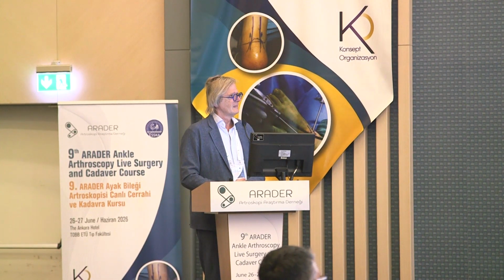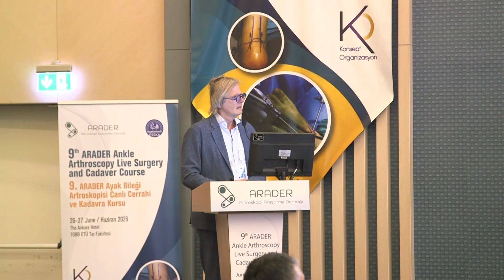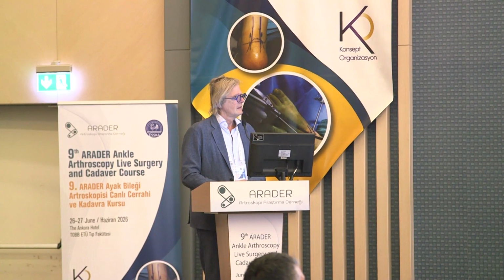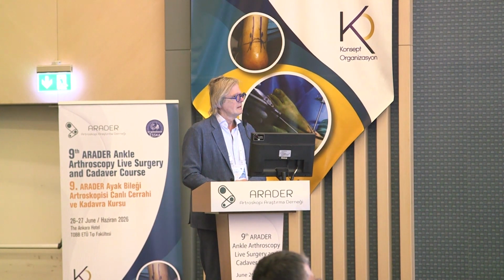Yeah, I want to ask a question just for me. You have an extraordinary career and you witnessed so many things about ankle arthroscopy. We all know that there was an article in 1939, Burman published that the ankle was not a suitable joint for arthroscopy. Now, we learned so many things. We use anterior ankle arthroscopy, we use posterior ankle arthroscopy for cartilage problems, for impingements, for other problems. We use it for arthrodesis, for fracture treatment, many things.